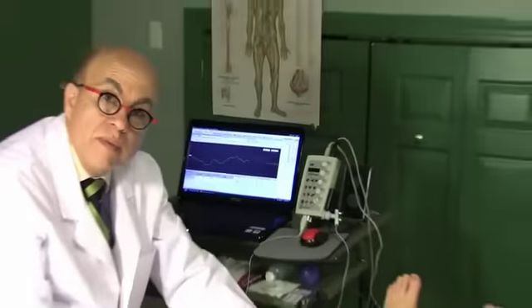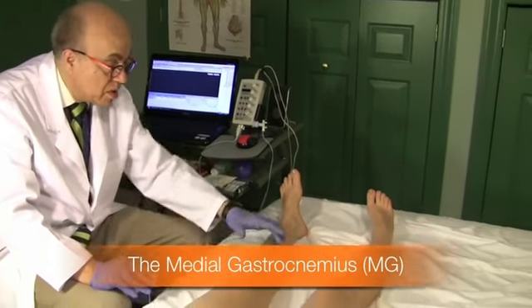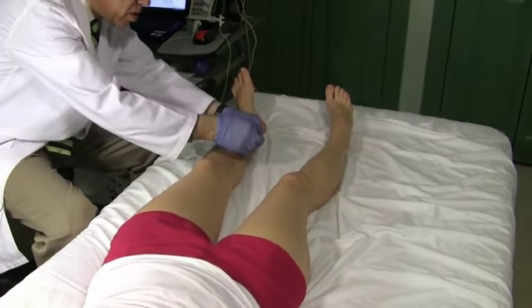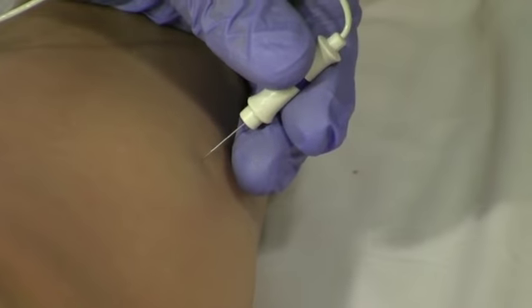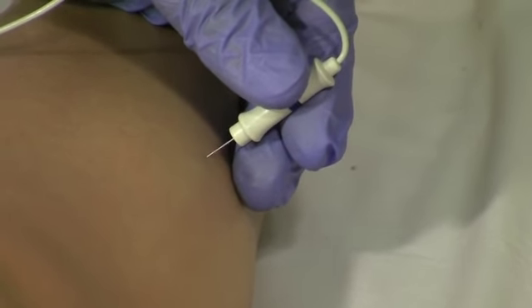The needle is out. The next muscle we're going to study is the medial gastrocnemius. This is a tibial innervated S1, S2 muscle. It's right here. It's a calf muscle. And here I stick the needle like so. 1, 2, 3. That's it. And I'm going to do insertional activity. Again, it stops as soon as I stop the insertion.